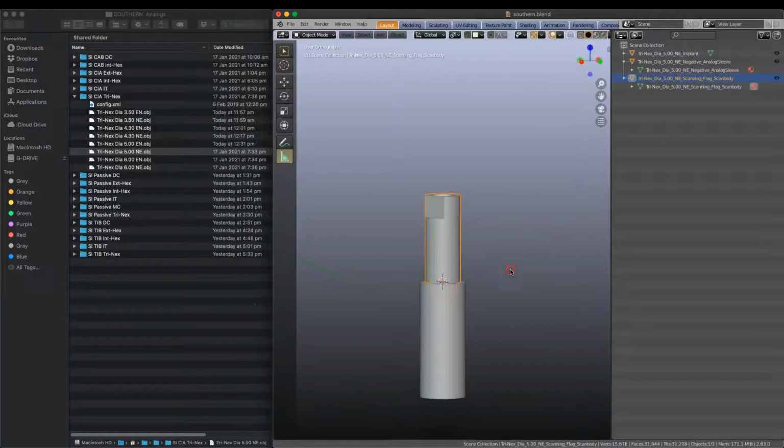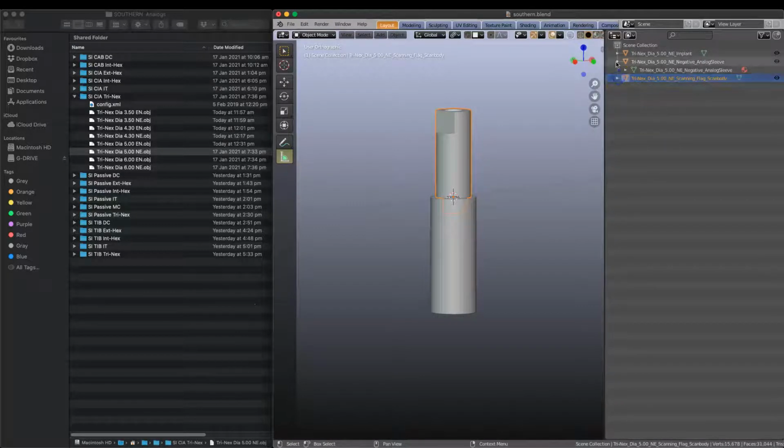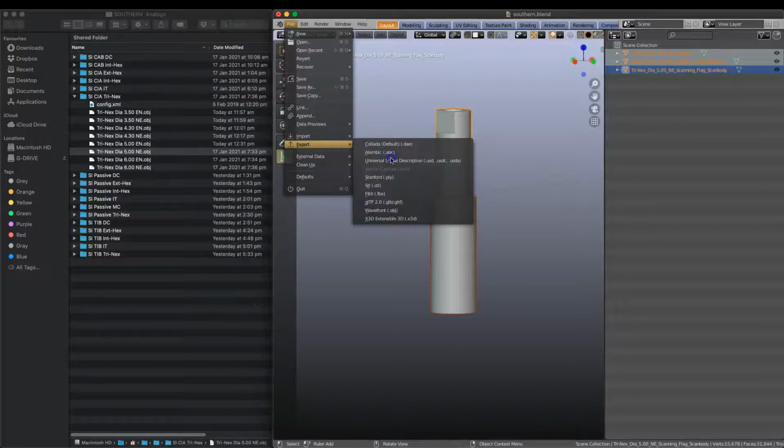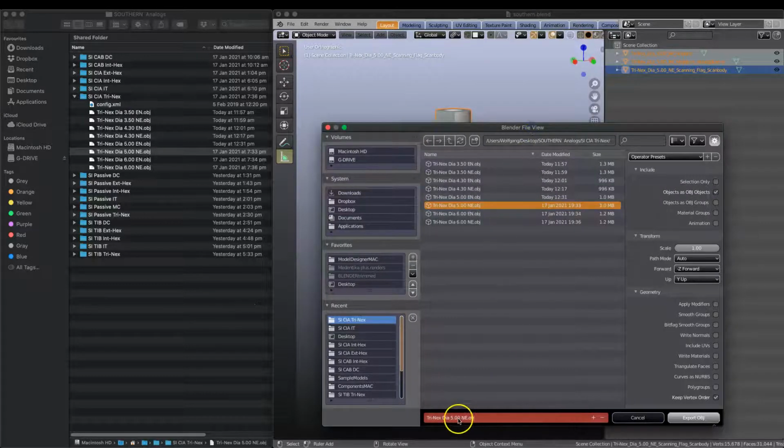Tab out of there. So let us test our little gadget here. Before we do that, I'm going to just save this. So select all of the parts, go File, Export, OBJ, ensure that only this checkbox is ticked and that none of these are ticked except for the bottom one. Okay, so we're going to match that to, we're going to override it. It is red down here in the bottom here because Blender is telling us we're going to override something. Make sure the component names are correct so that they're correctly matching in your Explorer, in Blender, and in the Blender window. And then you're going to just push export.